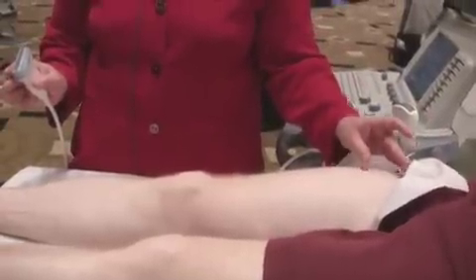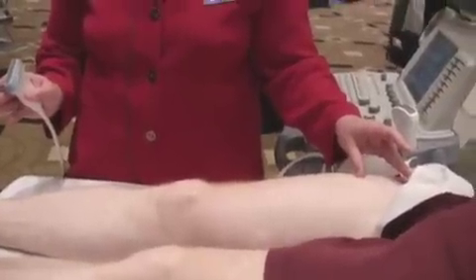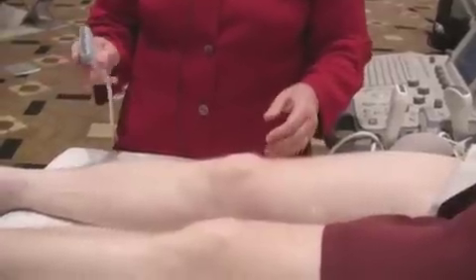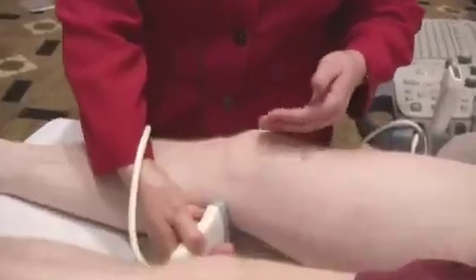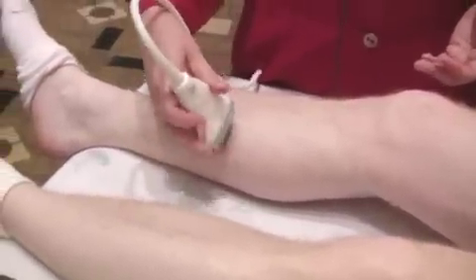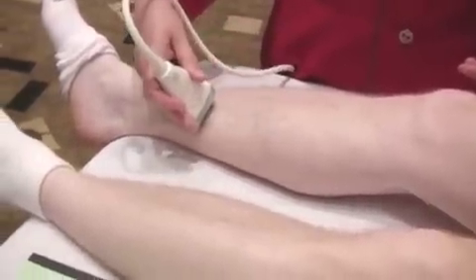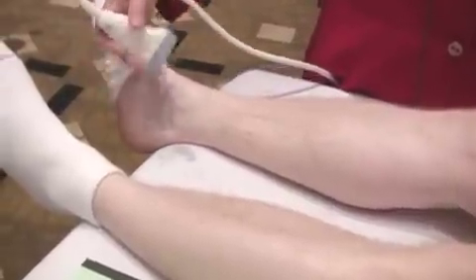Up at the top, we looked at the common fem and the origin of the profunda femoral or deep femoral artery. We scanned through the whole length of the superficial femoral artery. Then we came from behind the knee like this, and we evaluated the popliteal, the takeoff of the anterior tib, the tibial peroneal trunk, and then from a more posterior medial approach in through here, we followed the posterior tibial and peroneal arteries down, following the posterior tibial artery behind the ankle.